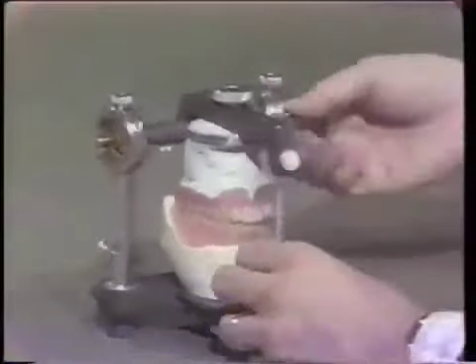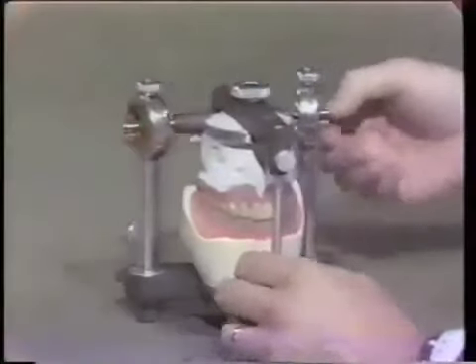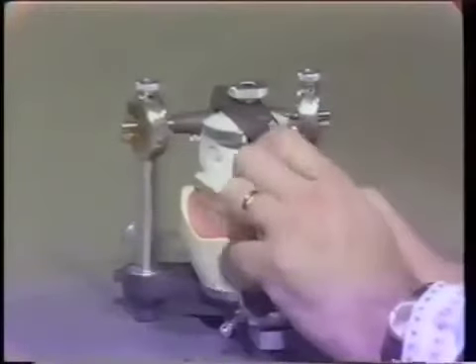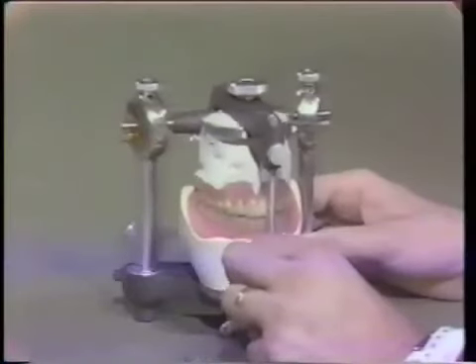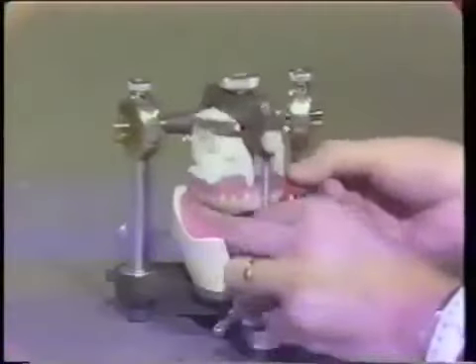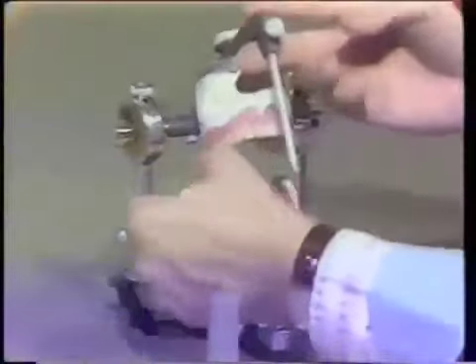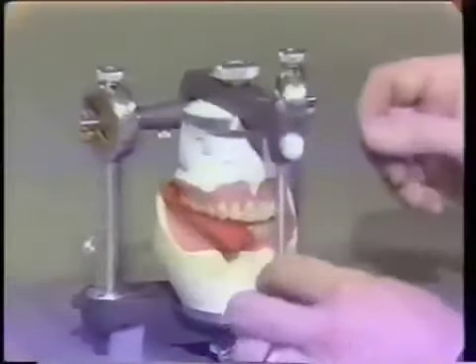For the first step, as discussed, using your handout, let's lock the condyles so the articulator can only swing up and down on the axis. To make sure they're all the way down, I'm going to raise my pin just a little so the teeth touch first. So as a first step, let's see what contacts, interferes, or does not contact in our hinge movement or centric occlusion.